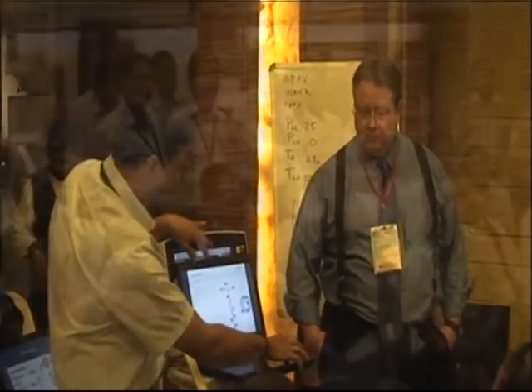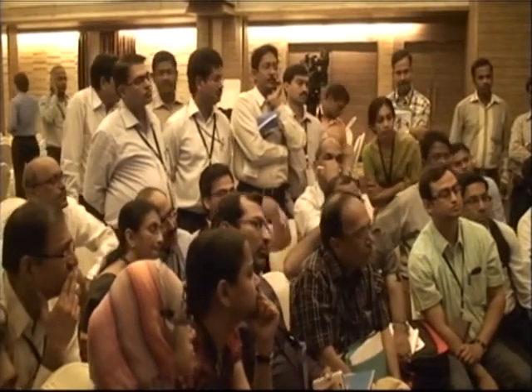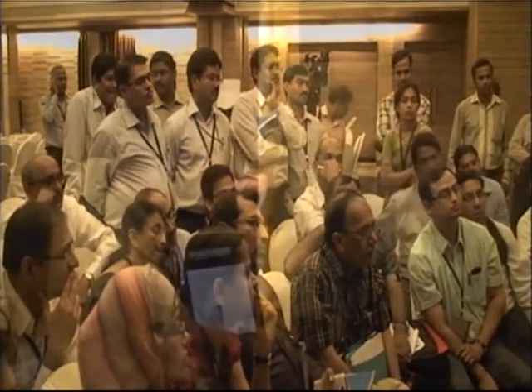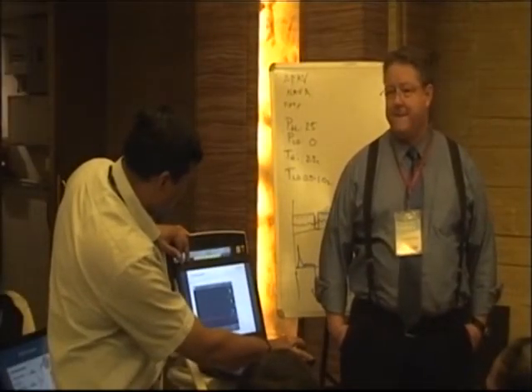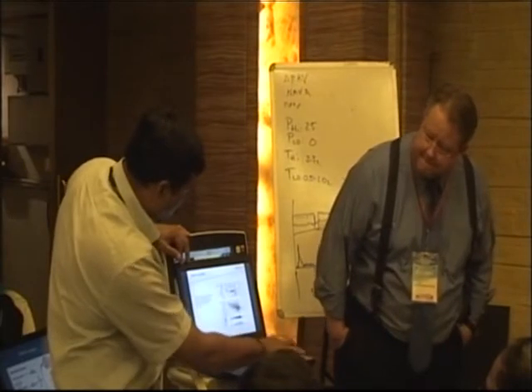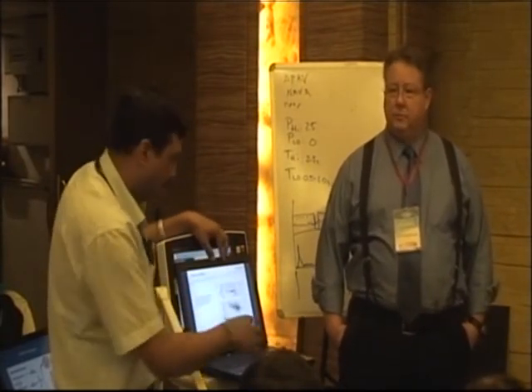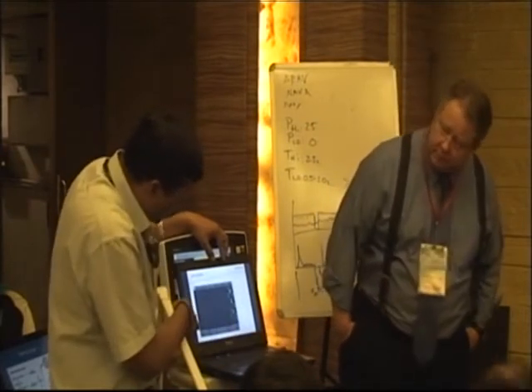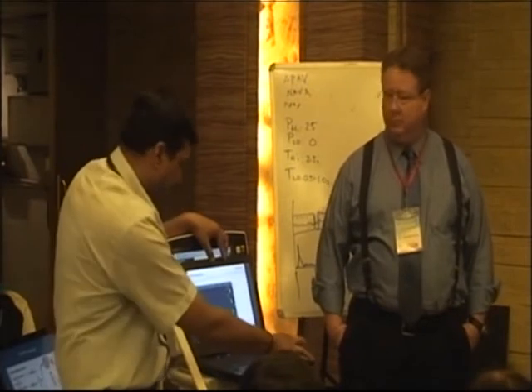Depending on the patient, we decide what size catheter he requires. It starts from 6 to 16 French. So this is a sterile pack, and then we get this diaphragmatic electrical activity, which is refined, and then it is given to the ventilator. So we have this NAVA signal which is coming. It is synchronized with the patient. The machine will synchronize with the patient.